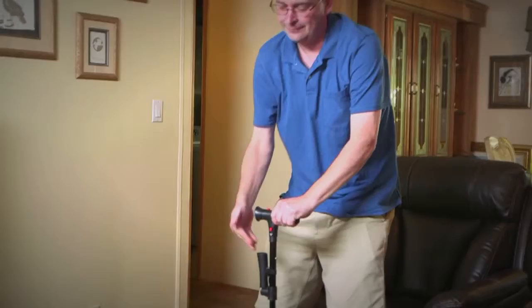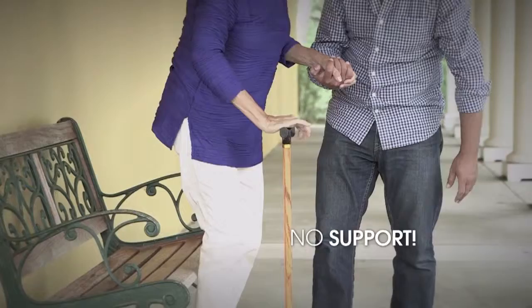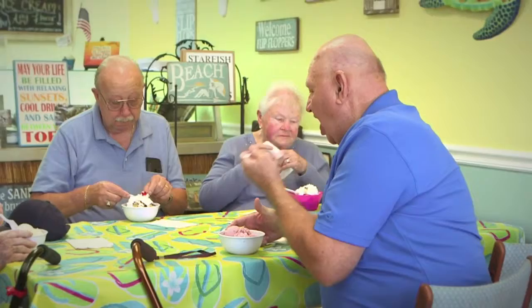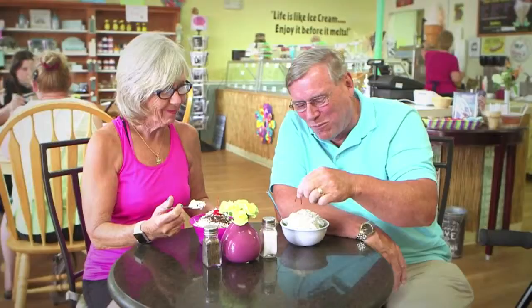My favorite feature of the Clever Cane is the two handles, because when getting in and out of the chair it gives me extra stability and something else to hold on to — something that's easy for most people and harder for someone who's had spinal surgery. A traditional cane just doesn't offer enough support when it comes to getting up and about. Grabbing furniture is dangerous and could lead to a fall. Resorting to those expensive chairs can cost hundreds of dollars and they can't go with you. You can't afford to not own a Clever Cane. To show how versatile the Clever Cane is, we showed it to some first-time users at the Silver Sneakers Retirement Community and asked them how it compared to other popular canes on the market.